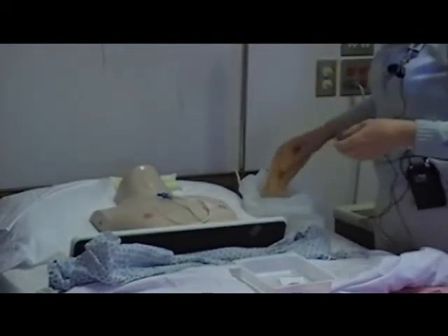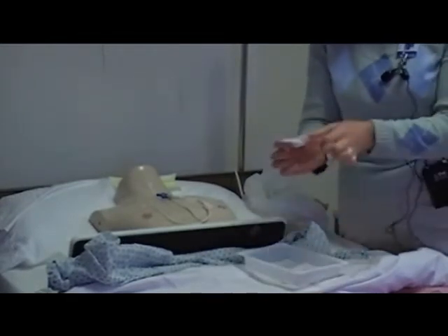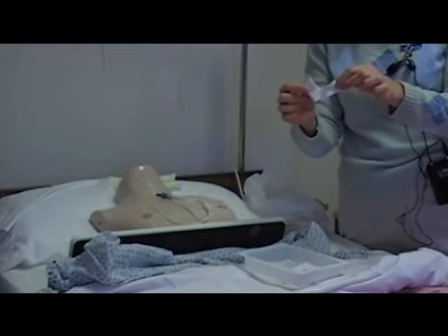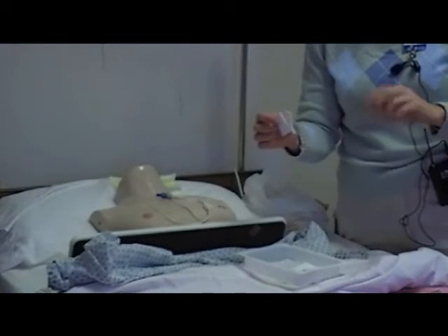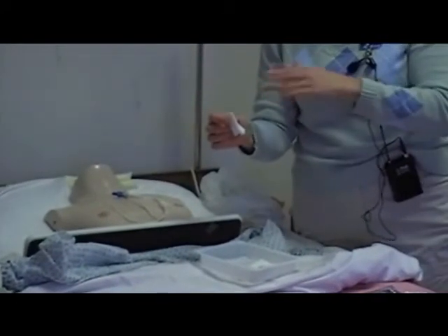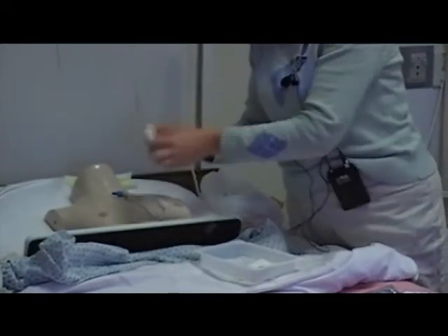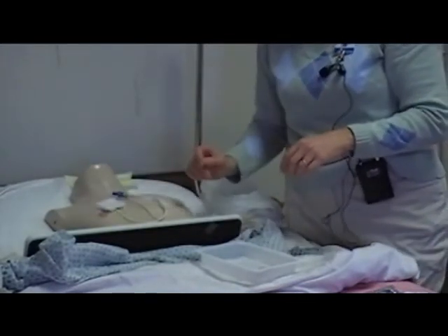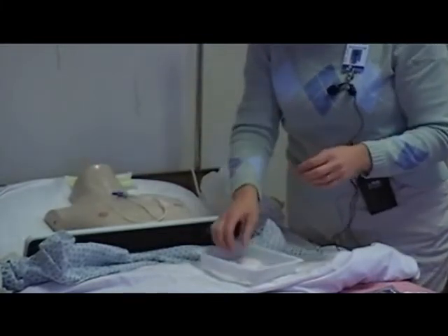And you'll notice there are a few leftover supplies within the kit. There's some 2x2 gauze and also a split 2x2 gauze. See what your policy says. There are a few occasions when this is a very new insertion that you will be using the gauze just because it's going to help to absorb any blood that may be coming. But usually after they've had their catheter in for at least a week, you're not going to use this at all. If you were to use it before you put the transparent dressing on, the split gauze would go around the catheter and this would be placed on top of the catheter, and then your transparent dressing would go on top of that. However, you don't use that very often.